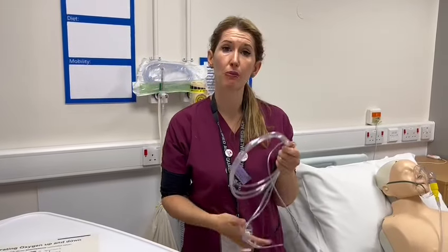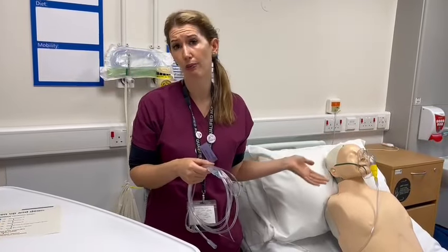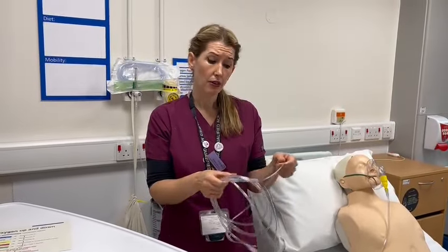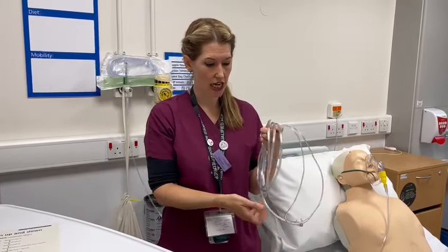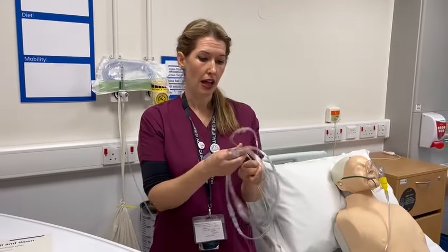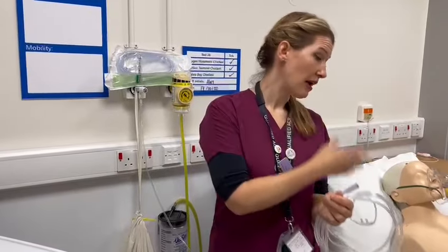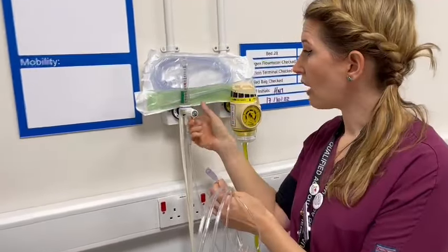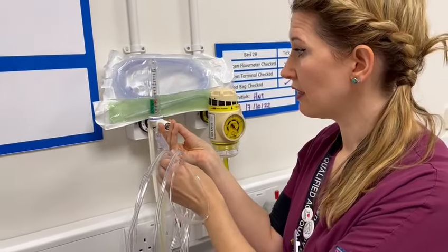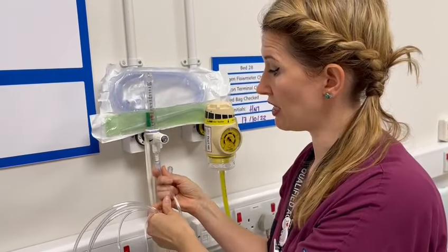According to our chart, if we want to convert them to nasal cannula, we want to put them on 4 litres. We don't want to leave our patient without oxygen because they are hypoxic and need this amount to support them. So I would make sure that I have everything available when we're starting to make that change. Make sure you get hold of your nasal cannula and open it from your packet. I am going to explain to my patient what we're going to do. I'll come to my flow rate here, reduce that down to 4 litres, then remove the venturi mask and switch, pushing hard on with the nasal cannula.